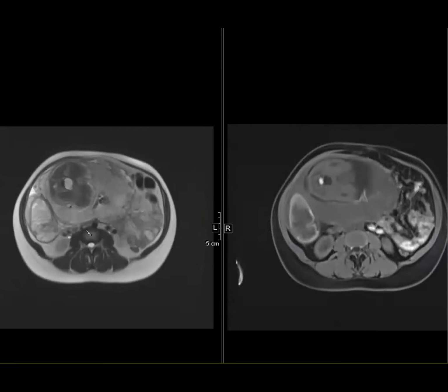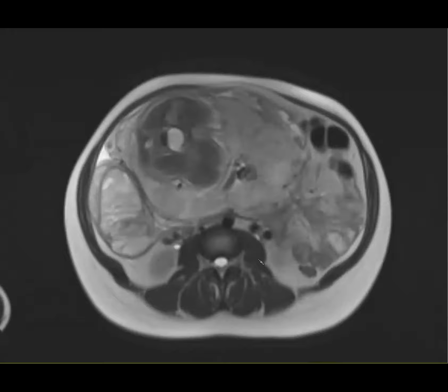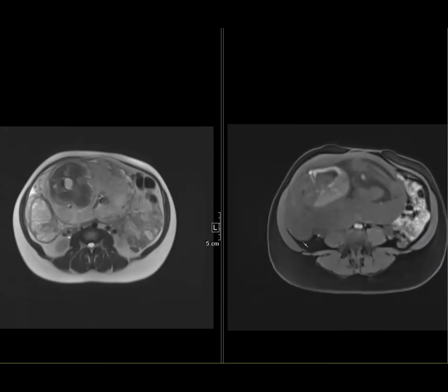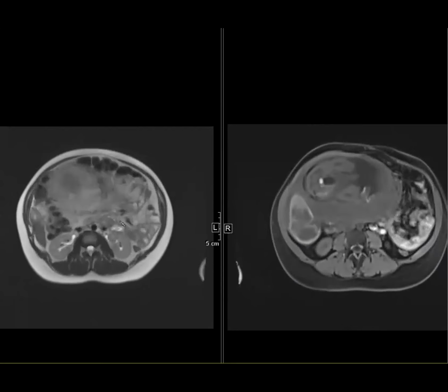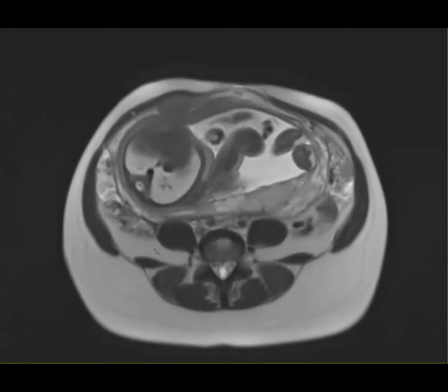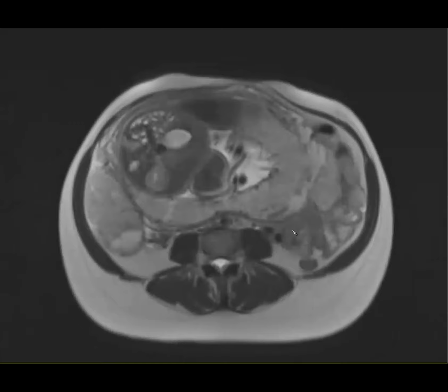So this was the right ovary, and it looked enlarged. It had this T1 hyperintense, probably hemorrhagic lesion. So we were concerned about hemorrhagic torsion here. And actually, Melina, I think this was your case. They took the patient to the OR. The gonadal vessels are abnormal too. They're a little dilated, maybe. Yeah, I didn't think I saw a definite swirling. Maybe a little. It doesn't look out of proportion to me to normal pregnancy.